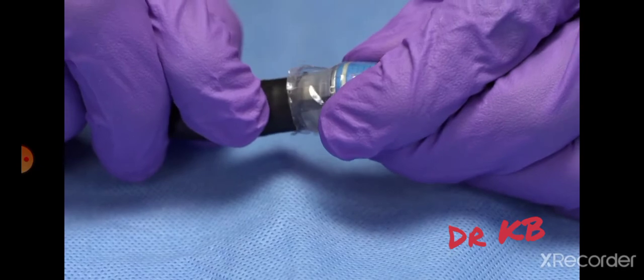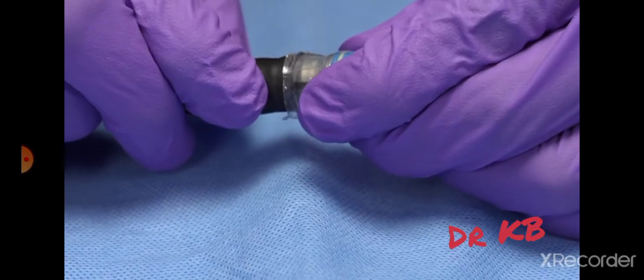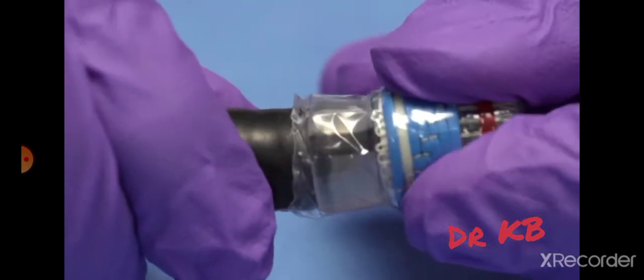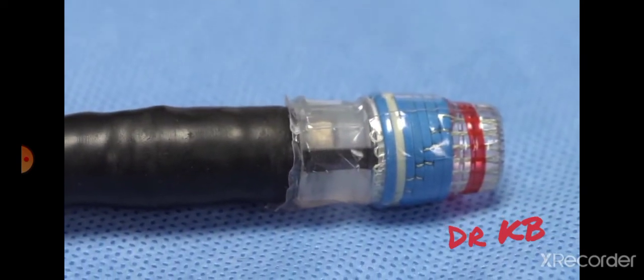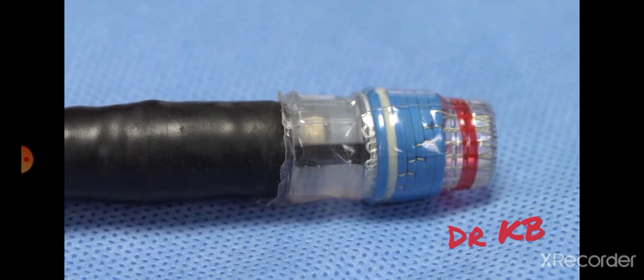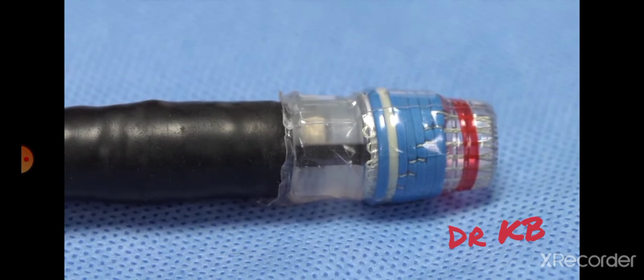Secure the ligating unit to the endoscope by twisting or rocking the soft proximal adapter of the ligating unit while pushing it onto the distal tip of the endoscope. The ligating unit should be pushed until the tip of the endoscope is up against the rigid part of the ligating unit cylinder.